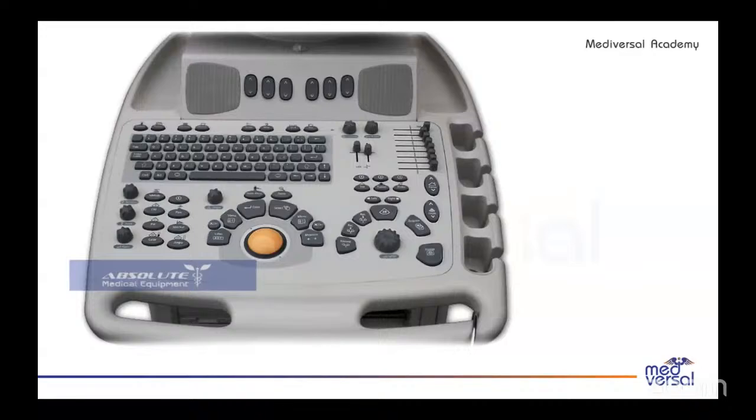On the left side, you see the M mode and CW, that is continuous wave Doppler. We discussed it last time. Continuous wave Doppler is for measuring the gradient of the aortic valve. And the pulse wave Doppler is basically to measure the gradient across the mitral valve. Or you can do tissue Doppler imaging in the pulse wave Doppler, right? And then above, it's a keyboard, if you want to type the patient's entry.